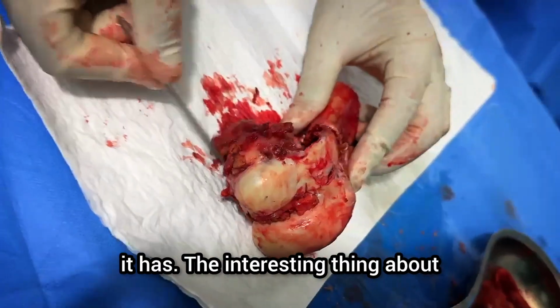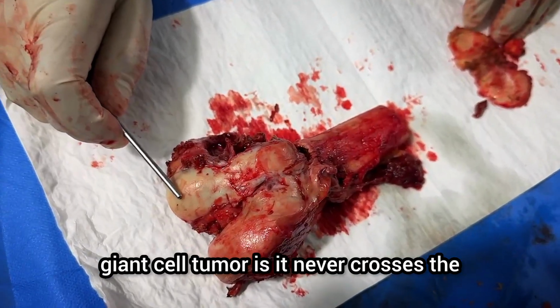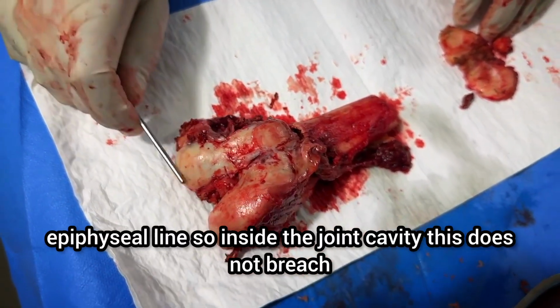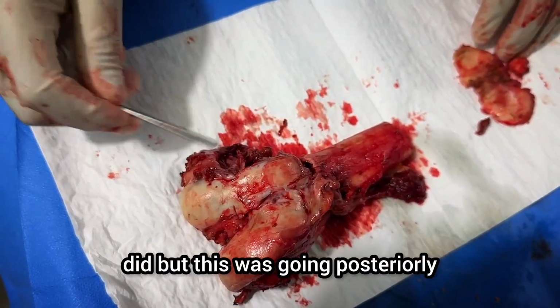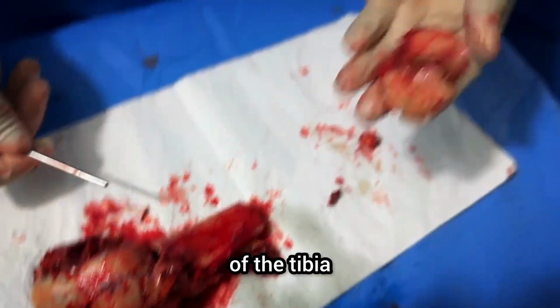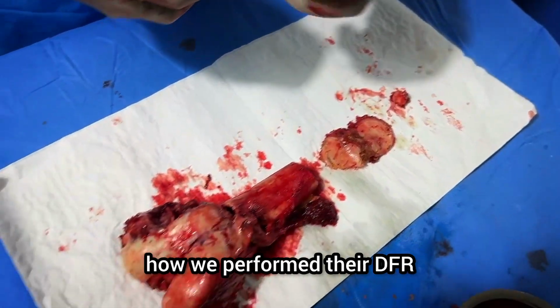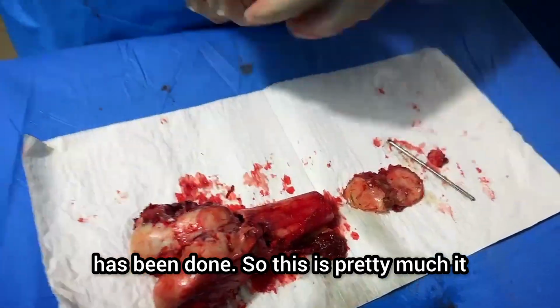The interesting thing about giant cell tumor is it never crosses the epiphyseal line. So it had not breached into the joint cavity, but it was going posteriorly and laterally. Similarly, we have removed the articular component of the tibia, and now we'll show you how we performed the DFA. So this is pretty much it.